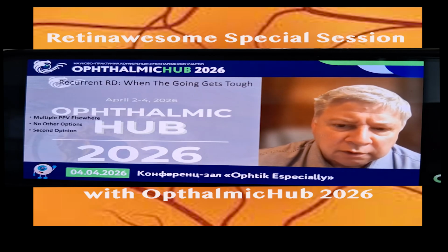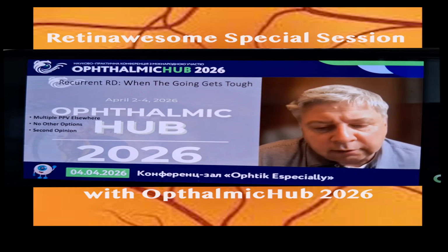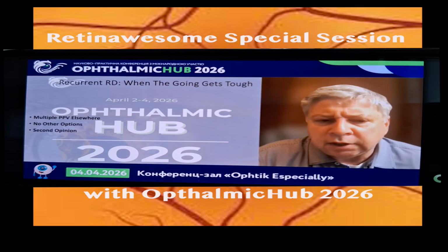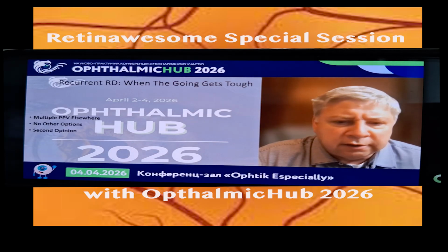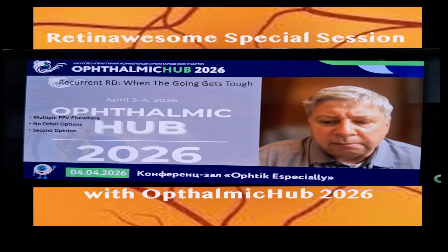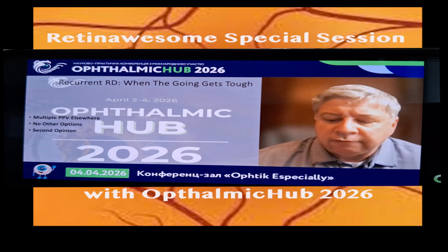Everything's in focus. So we were able to see very well with the C-Luma. We were able to project light well with the Stellaris. We're also working with Carl Zeiss to get their platform up and going. So in the next couple of years, hopefully we'll be able to show that if you want to do intraoperative fluorescein angiography, it can be done on a number of different platforms.